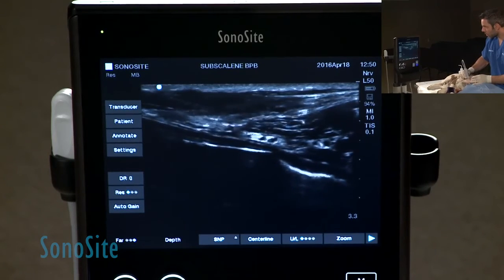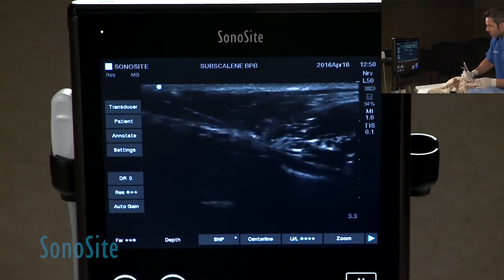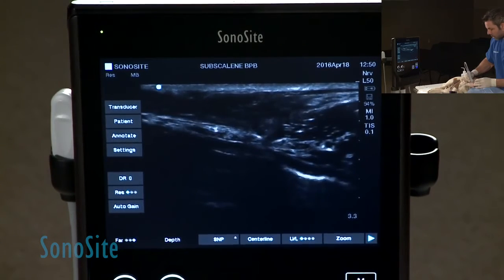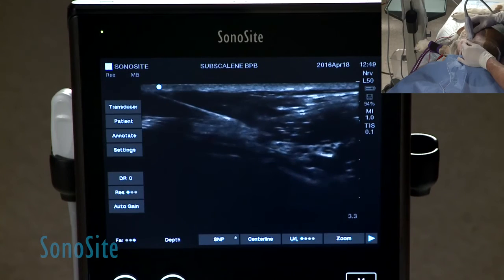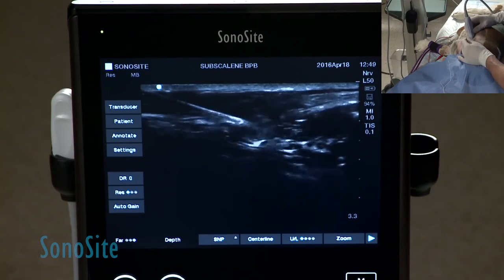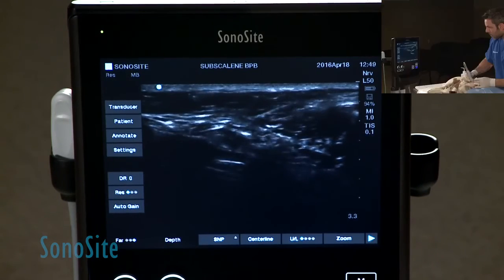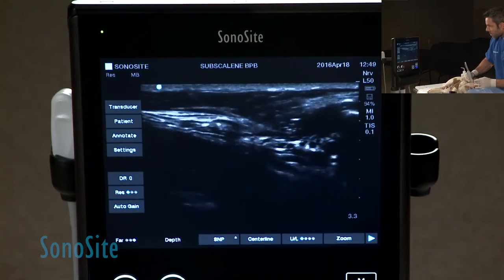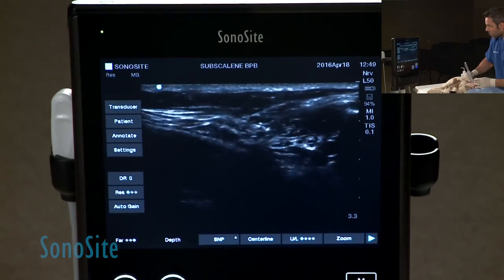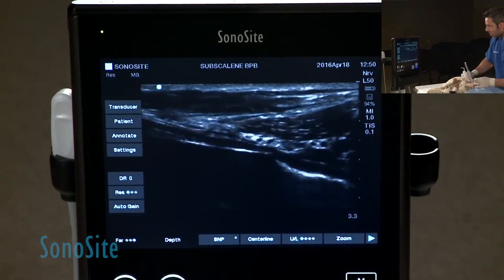You can see the needle coming out in proximity to the cranial portion. A lot of times I will turn off my stimulator at this point so I don't get interference during the blockade. I'm then moving again cranially to get the nerves. Because it's a very superficial blockade — the needle is just in the subcutaneous tissue, not much muscle over it — it's sometimes trickier to get a clear image of your needle for the complete block.